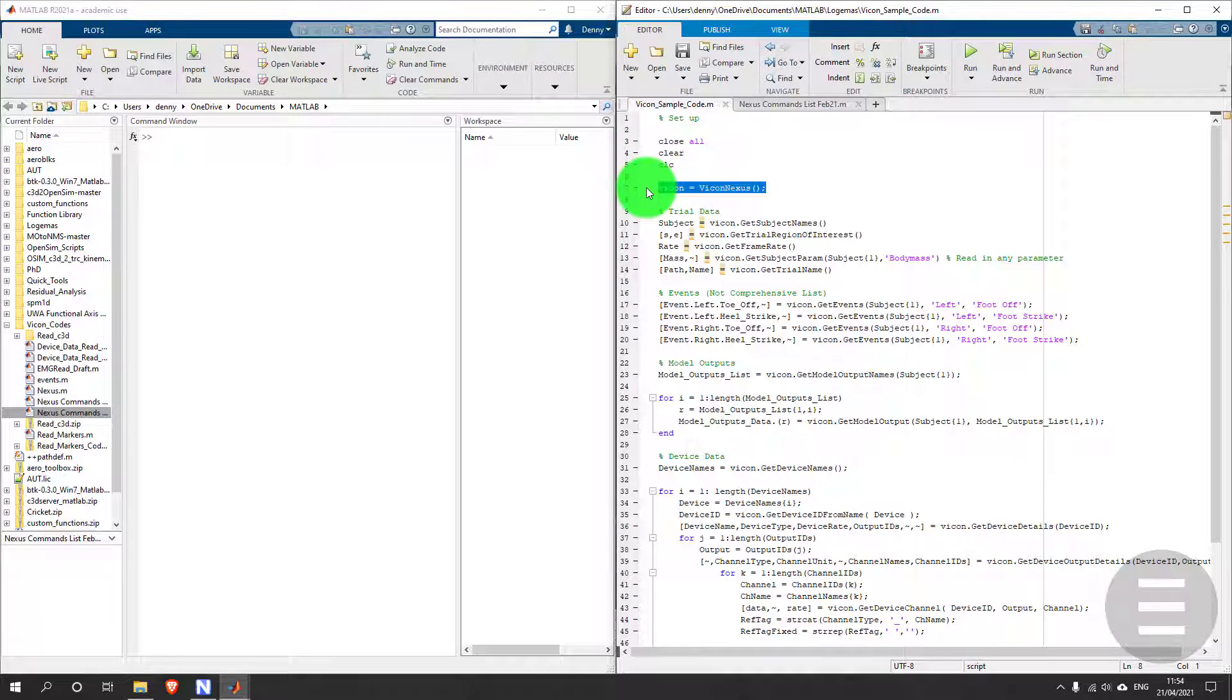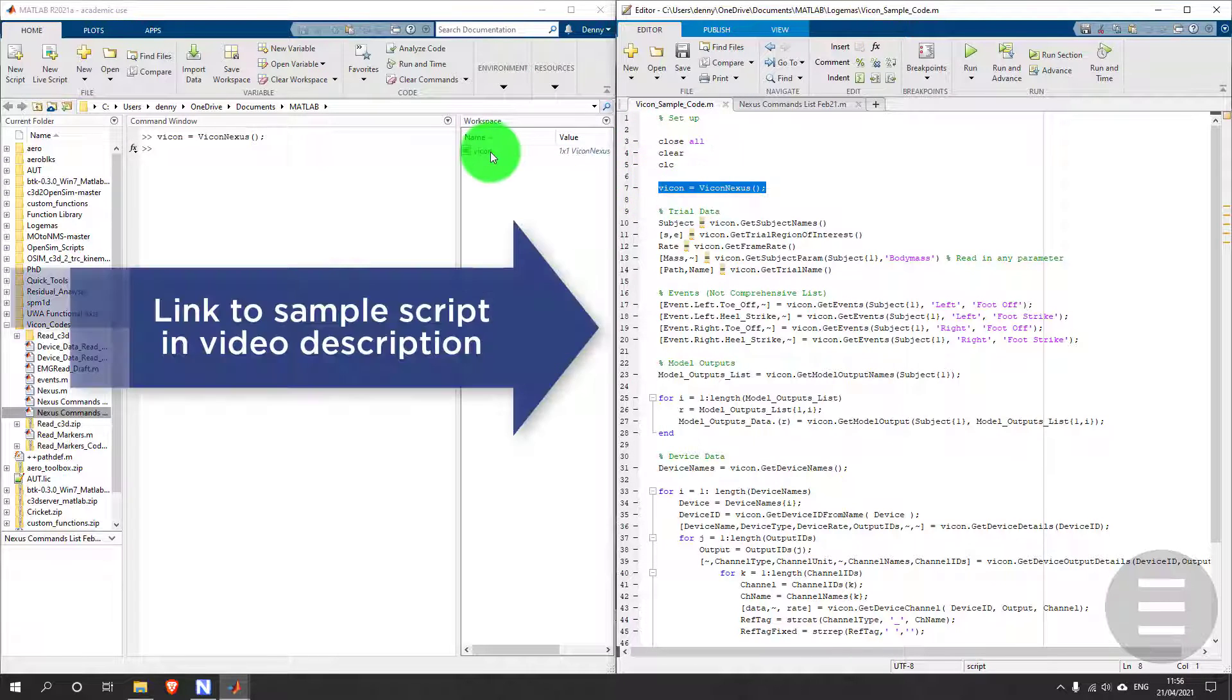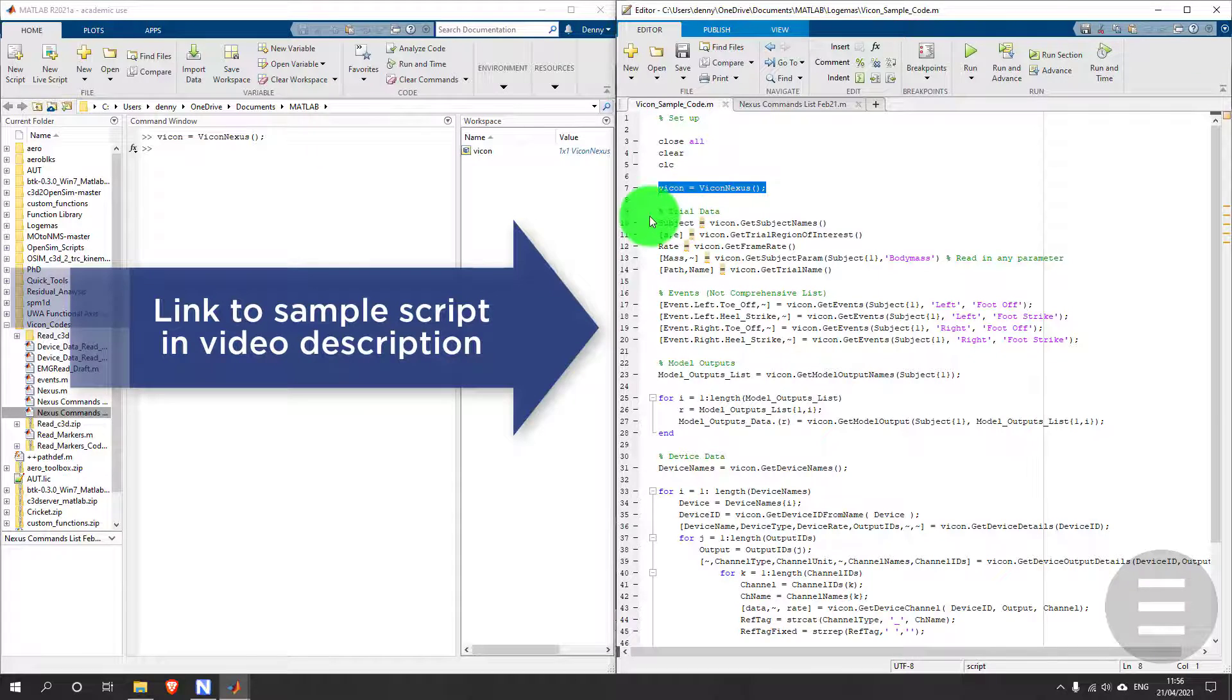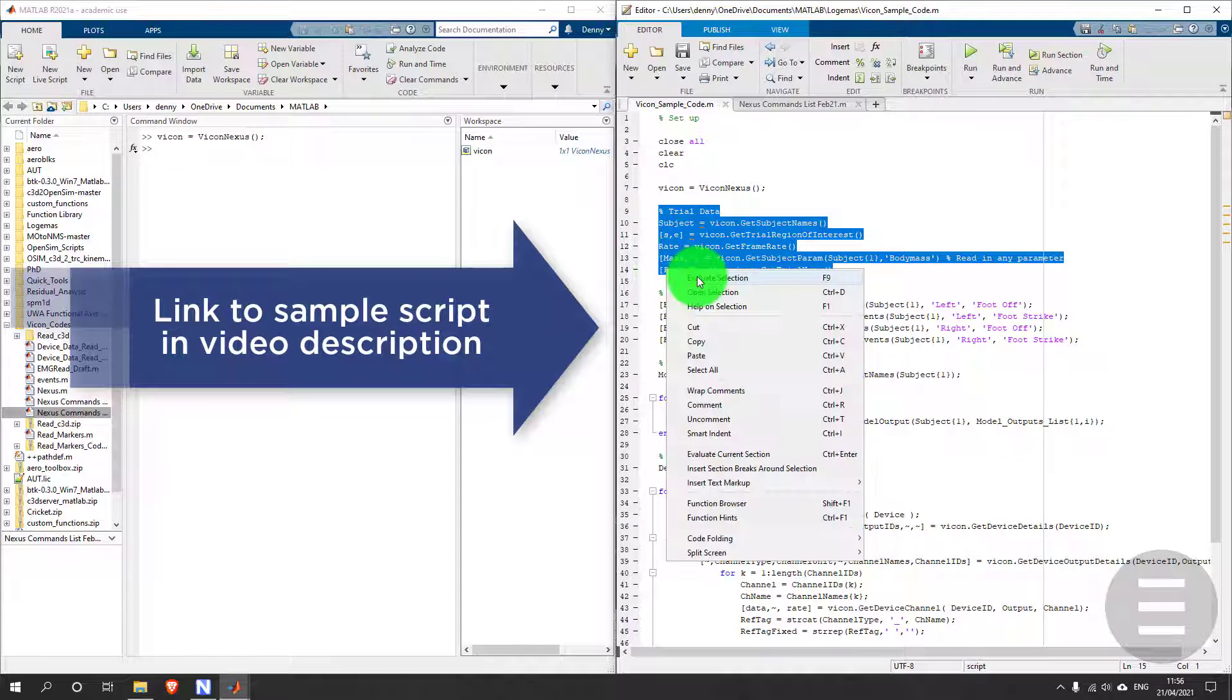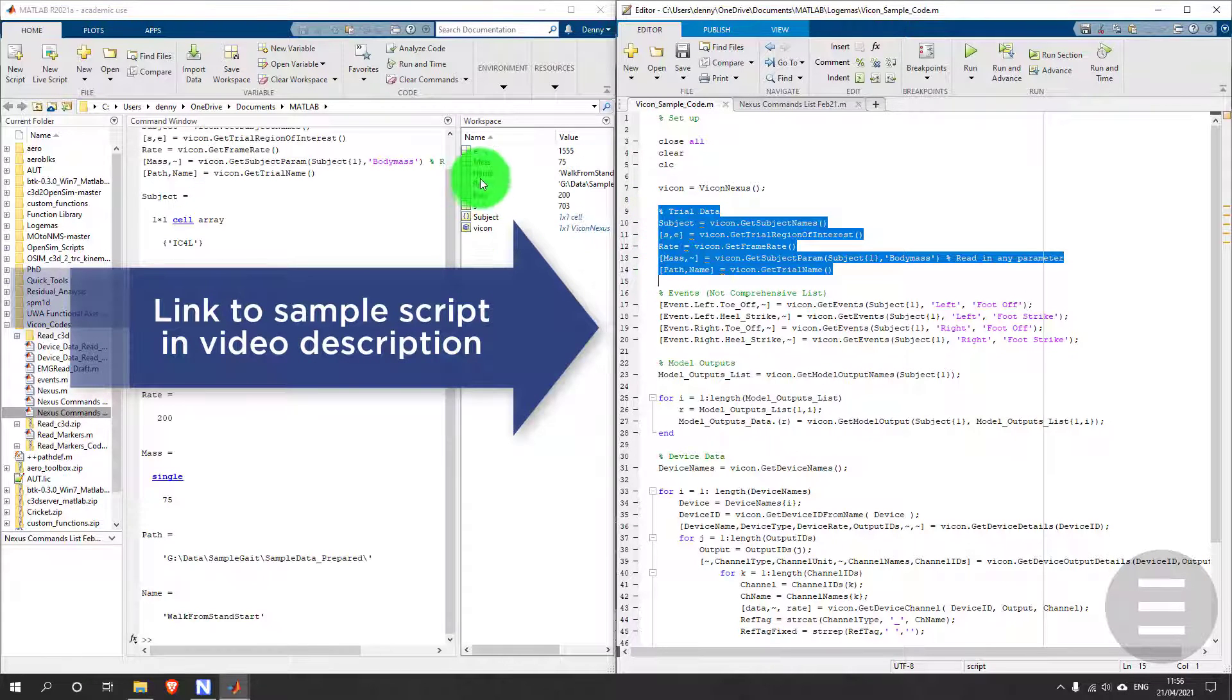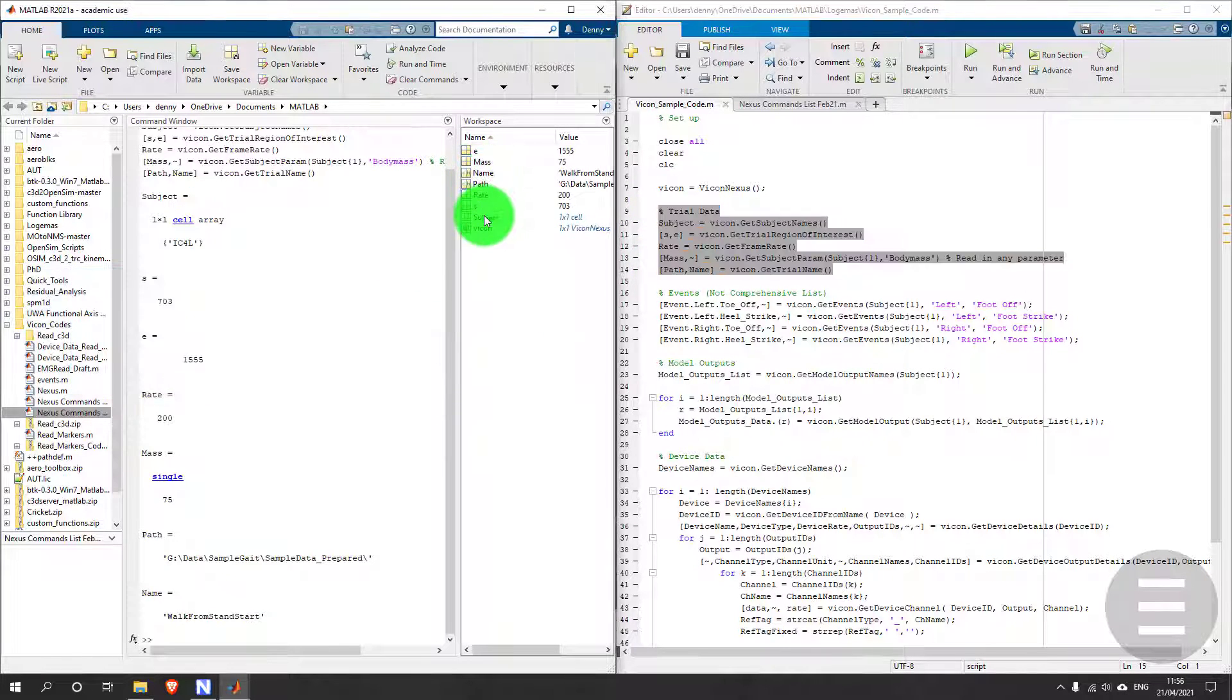Now the first most important line is this one in my code, and that creates the link between MATLAB and Nexus. And then I can run the rest of my script.